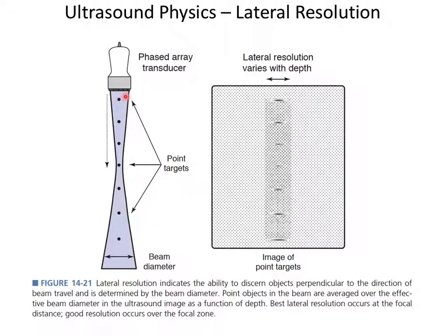So this shows the lateral resolution that is available as a function of depth through the object. And here's our phased array transducer.